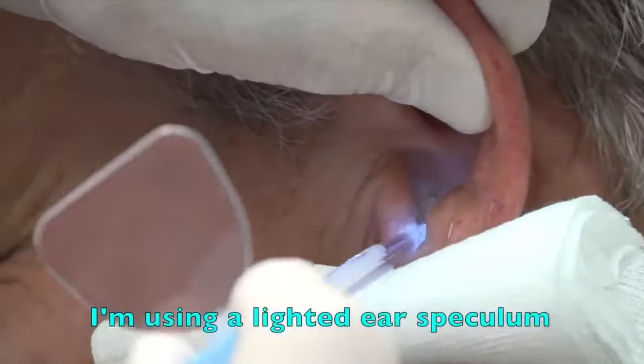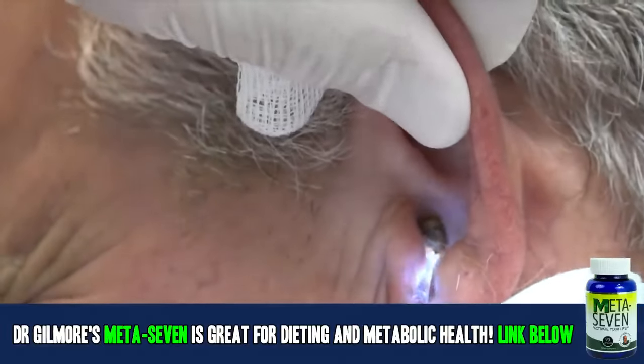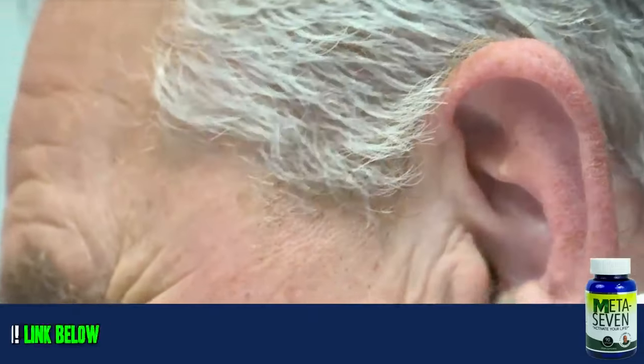Can you see okay, little Gonzo? Not really. Go right there. Is it hurting any? Well, I can feel it. Hearing a little popping. Do ya? We got a little piece right there. You got a big chunk coming out right here, my friend. Looks like a monstrous collection of cerumen right there.